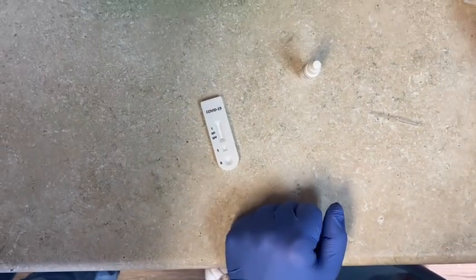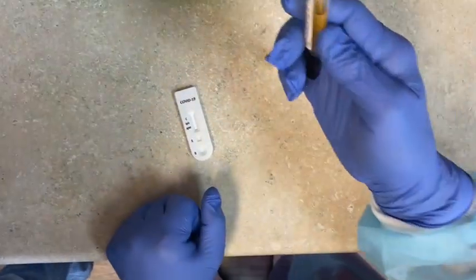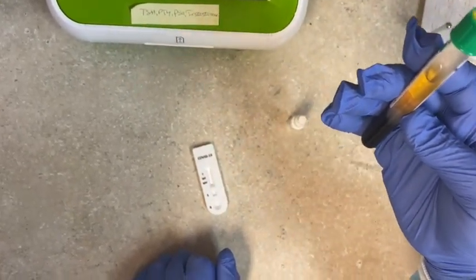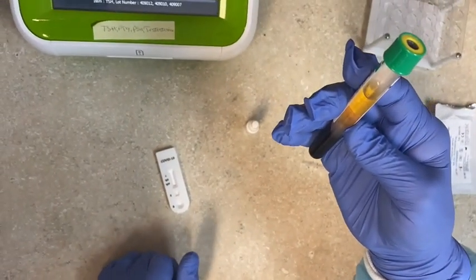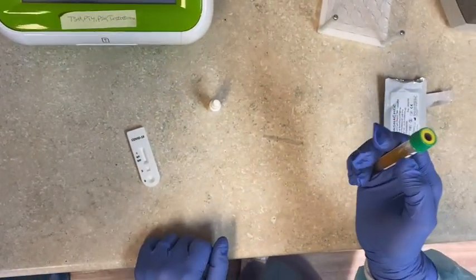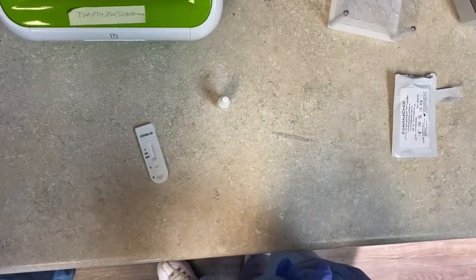You'll be drawing in a green top tube — this is what you'll be drawing in — and you'll have to spin it down. You're using the plasma off of the green top separator tube. Of course, you'll label it with the patient's first and last name and their birth date.